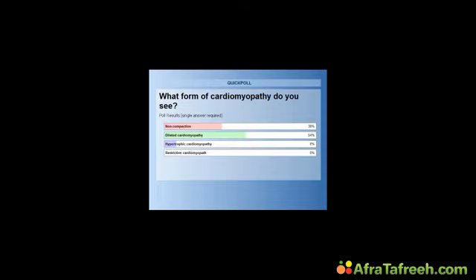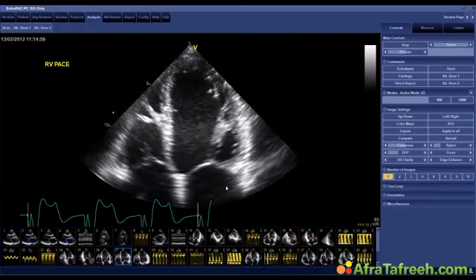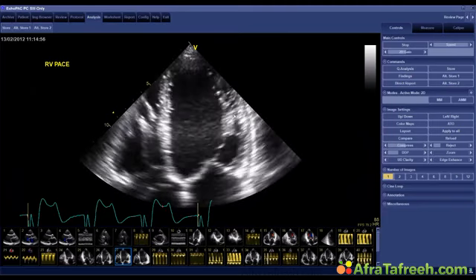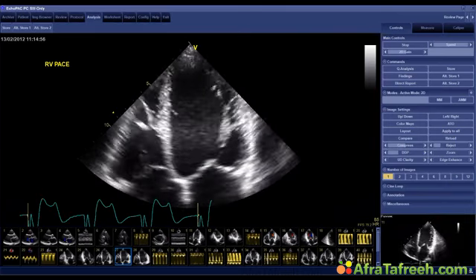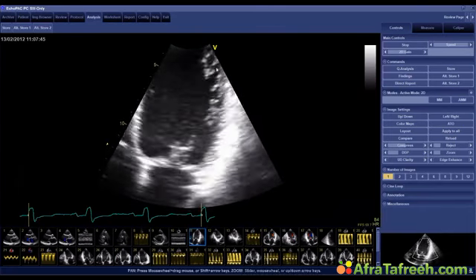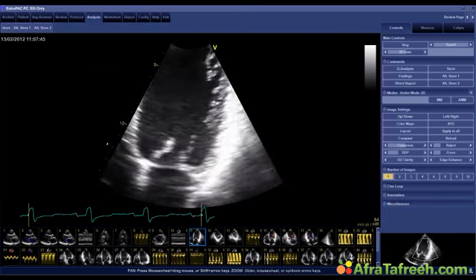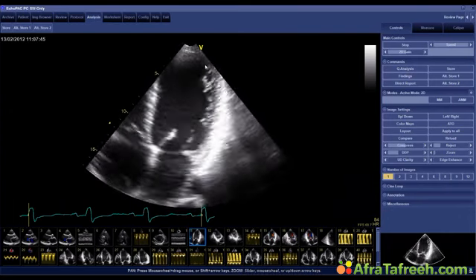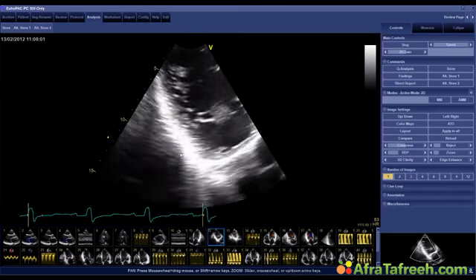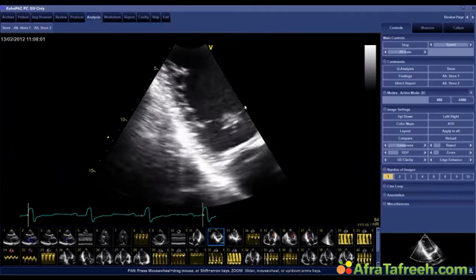And if we look very closely, we see a left ventricle which is not only dilated, but we also see that he has a very strongly trabeculated lateral wall of the left ventricle. With atypical views, you can see even more of this. I'll show you right here. This is very strongly trabeculated. You have little sinusoid kind of areas here in the myocardium. And this is a two-chamber view. And this is very typical of non-compaction syndrome. So the myocardium looks very cheesy.